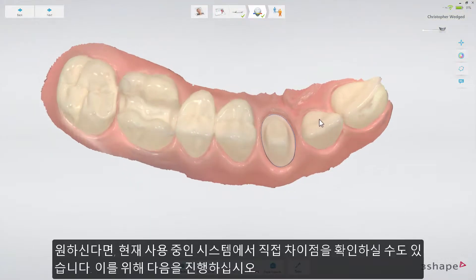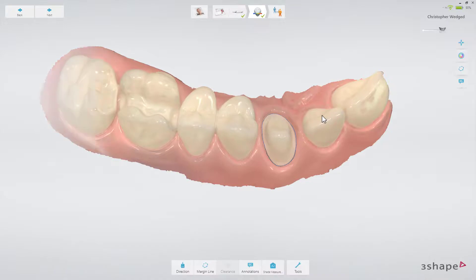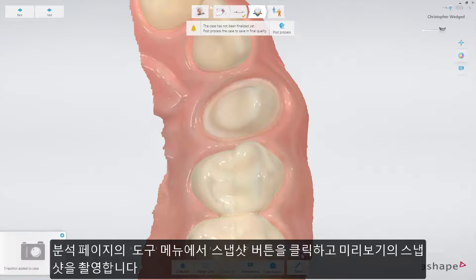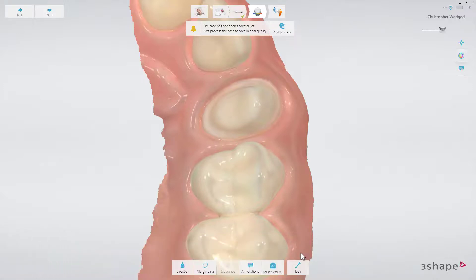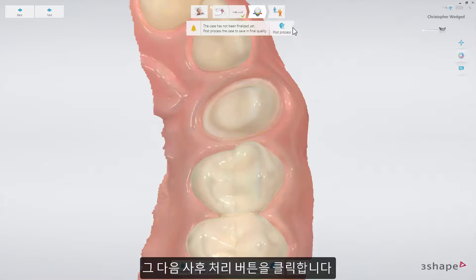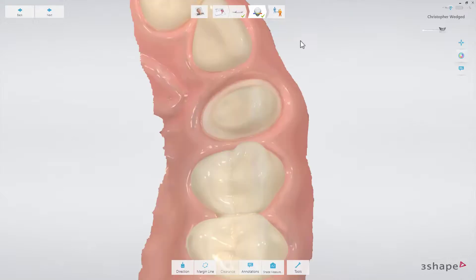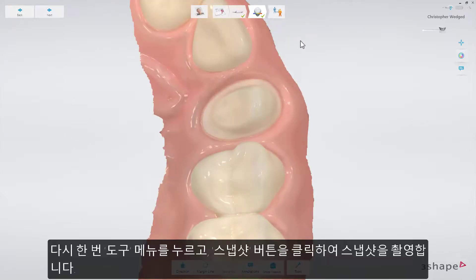If you wish, you may also see the difference on your own system. Here's what to do. On the analyze page, take a snapshot of the preview — select the tools menu and choose the snapshot button. Then press the post-process button. Finally, take another snapshot by selecting the tools menu and choosing the snapshot button.